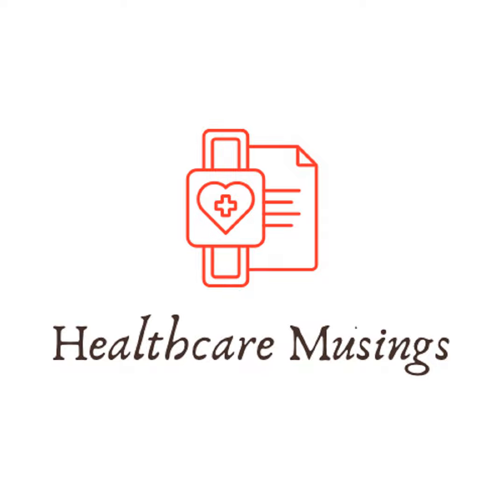Okay? So this has been shown in studies, old studies, that it increases work of breathing. Because you're getting only some breaths at the big tidal volume and then little guppy breaths. You know what I mean? So if they're breathing 20 times a minute, let's make the math easy, every 3 seconds, every 4 seconds they'll get a 450. The remaining time they'll get pressure support 10. So it's been shown to increase work of breathing.